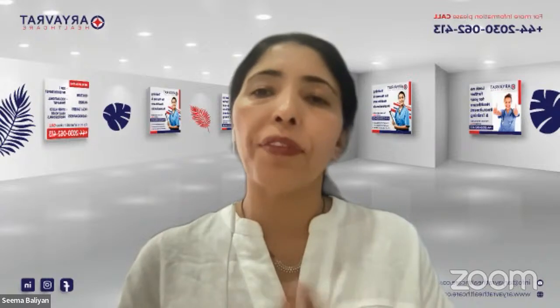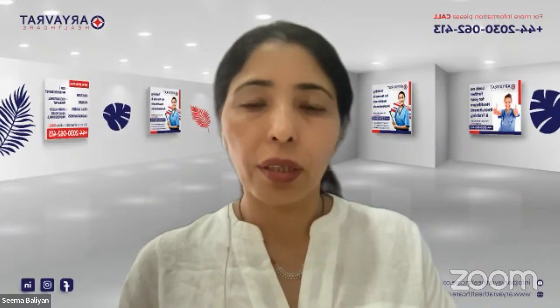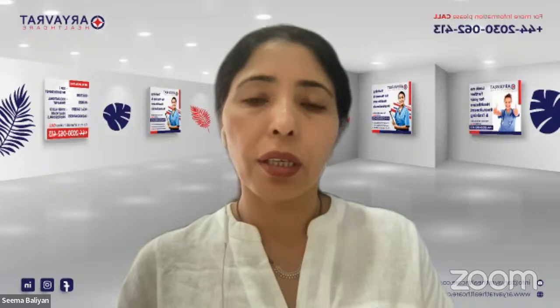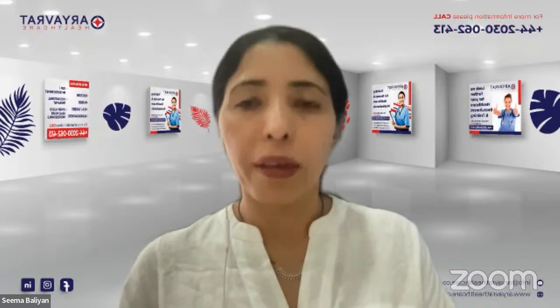Okay, is that clear to everyone, what instruction you are going to give to the patient? Yes, ma'am. Dr. Seema, what about a male patient? Because I think this is for a female patient. What if you have a male patient?